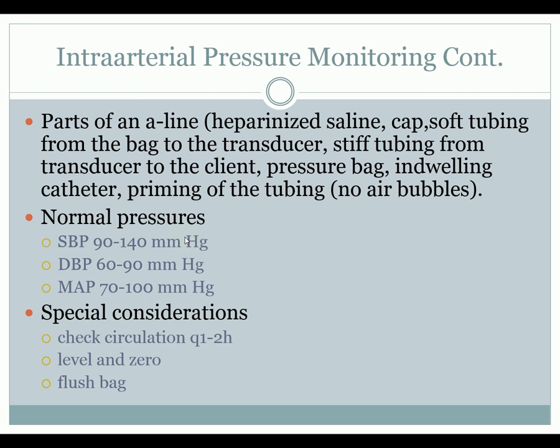And then if you start seeing blood coming back in your tubing from your ART line, the first thing you'd always want to check is that pressure. Did it fall? Because sometimes that loses air. Did it go below that 300 millimeters of mercury and lose some air? If it did, then you just pump it back up to 300.